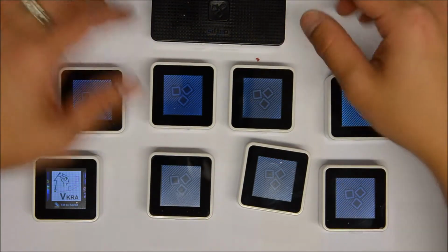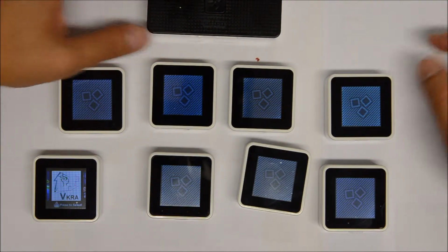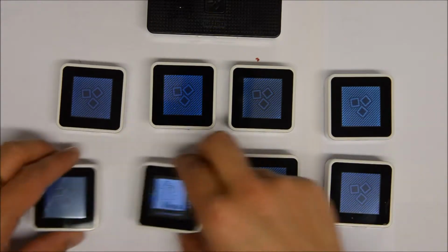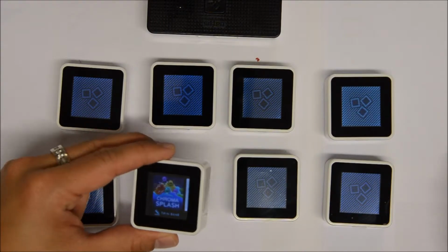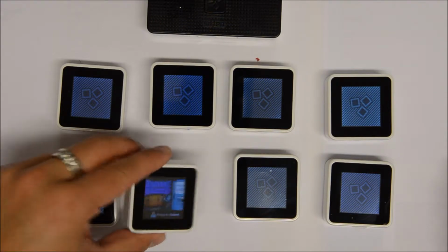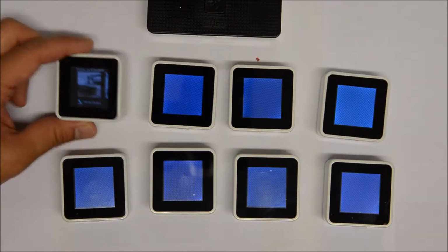And it has a 2.4 gig wireless connecting system to the base. So if you have the base nearby, you can have all the cubes connected to the system. The menu uses a tilt menu, so you can tilt it using the accelerometers, to the left or the right, to select any of the options you want, and touch to start the game that you have.